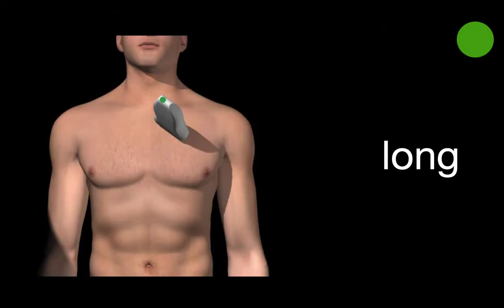So the first view is the parasternal long view. This is typically obtained by putting the probe in about the 3rd or 4th intercostal space, just lateral to the patient's sternum. And when you're rotating through the different views, you almost want to rotate in a clockwise fashion. So the first place that the indicator should be pointing is towards the patient's right shoulder. And this is the view that I typically start with and consider home base. So if I ever get lost, I always come back to this view.